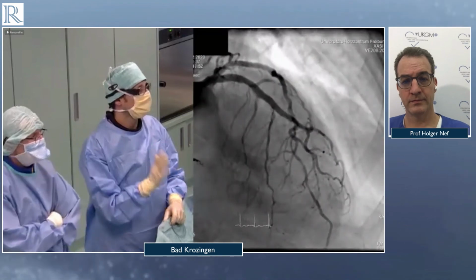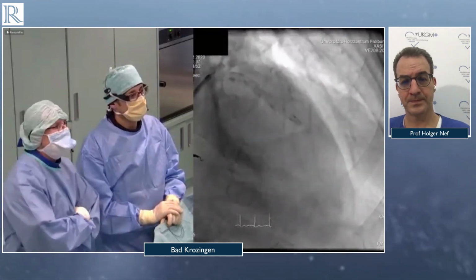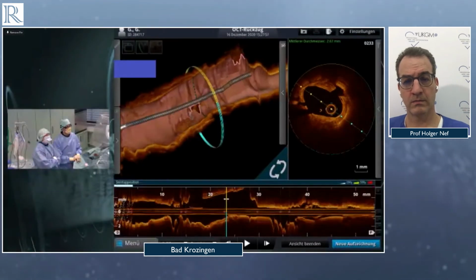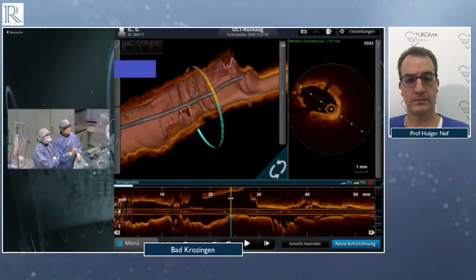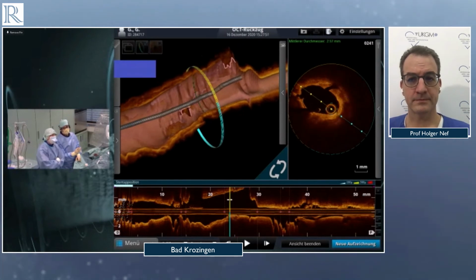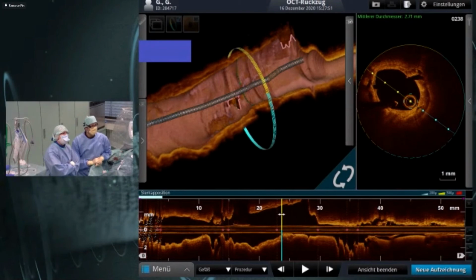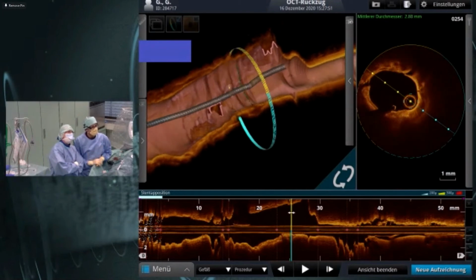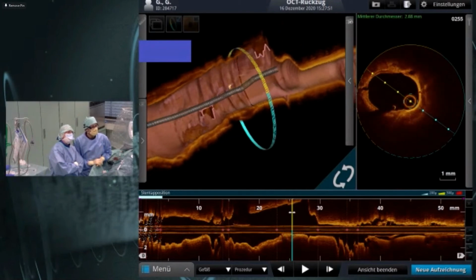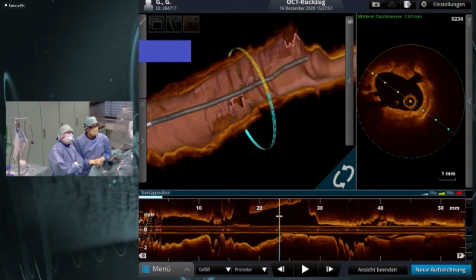And we want just to go back to the imaging to show you, because Dr. Löffel had already prepared us some very nice imaging models where you can see the plaque disruption from the IVL. It was really fantastic in this case, and you can see here the disrupted plaque at 10 o'clock and also at 2 o'clock. And this is great for lesion preparation there, right?